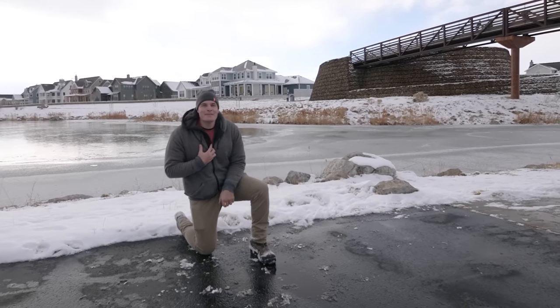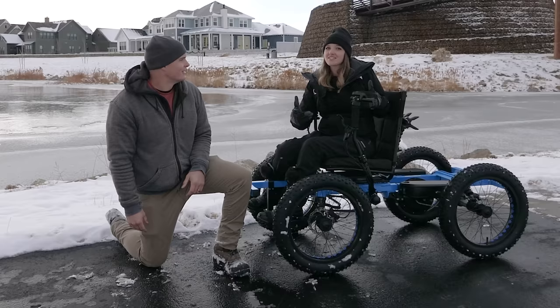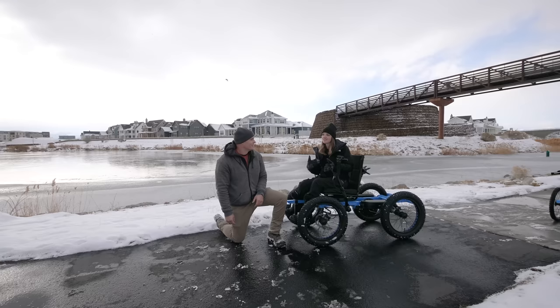My name is Zach Nelson and you've probably seen our four-wheeled off-road wheelchair that we've been selling for a couple of years now. It's gone in a lot of places — on dirt, grass, snow — we've taken it on vacations. It's been a lot of fun. We really enjoy this rig and what it can do.